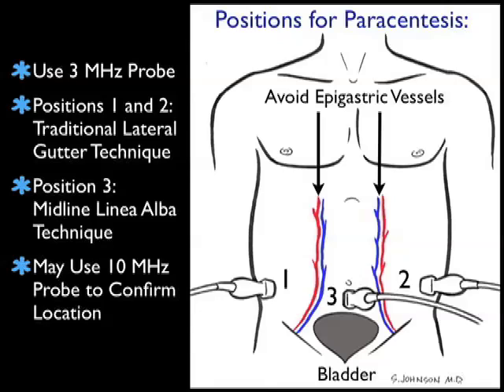We can also place the probe in probe position three, the midline linea alba position, below the umbilicus in the relatively avascular midline linea alba. We can also use the 10 megahertz higher frequency probe to get a better look at the abdominal wall in relation to the bowel and the ascites fluid prior to our puncture attempt. This will give us a more detailed look into the abdominal cavity to better plan our approach for the paracentesis procedure.